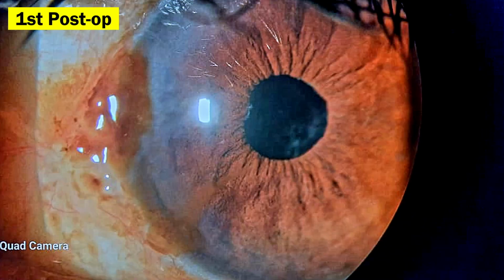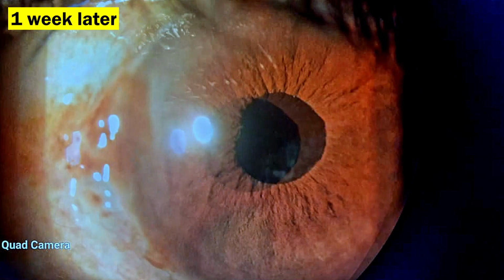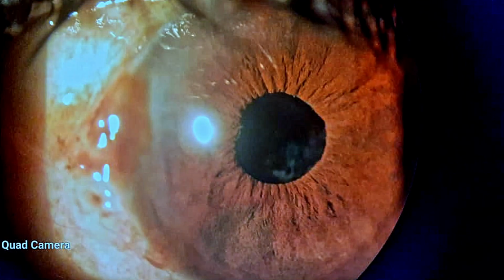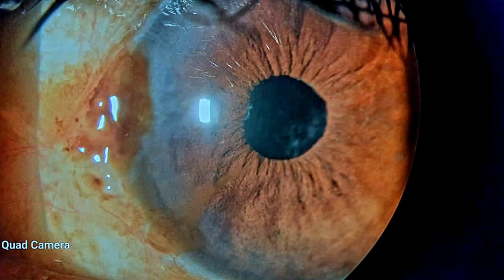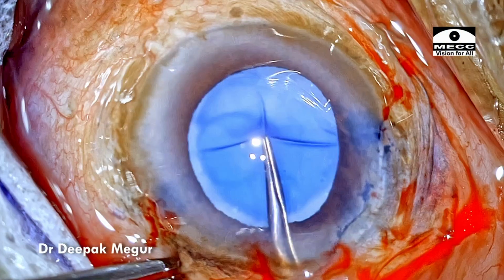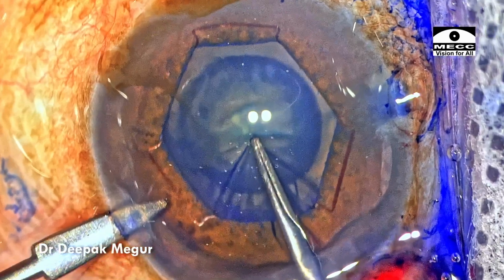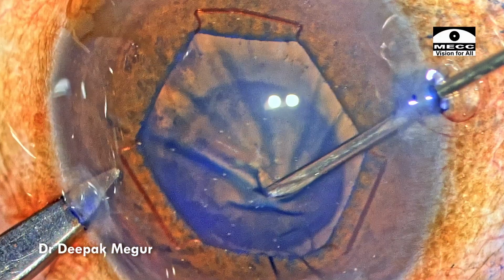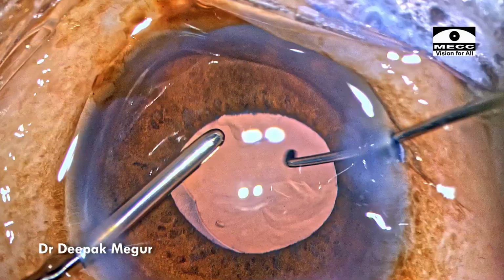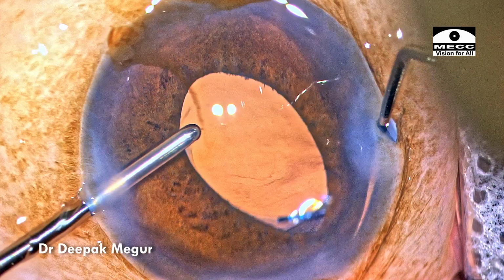And these are the first day post-op pictures, and this is 1 week later. The patient continues to do well. How long will the lens stay? Well, it's difficult to say, but in these cases of generalized zonular weakness, this is my preferred go-to technique. Of course, in this eye, the laxity was quite severe, but I would prefer this technique more in eyes with moderate zonular weakness. And they have served me pretty well.